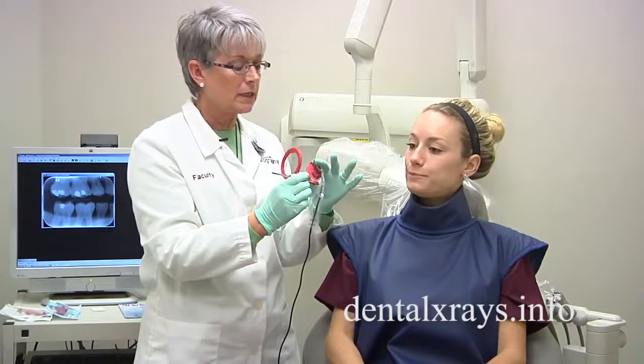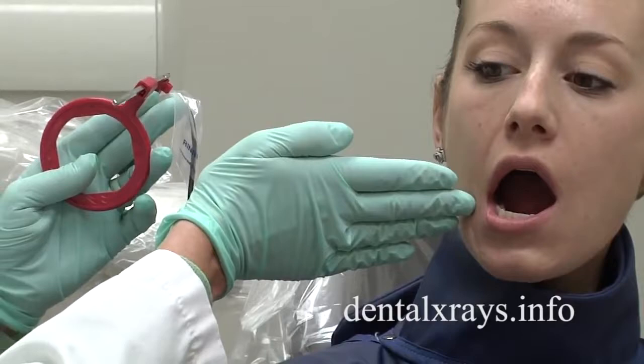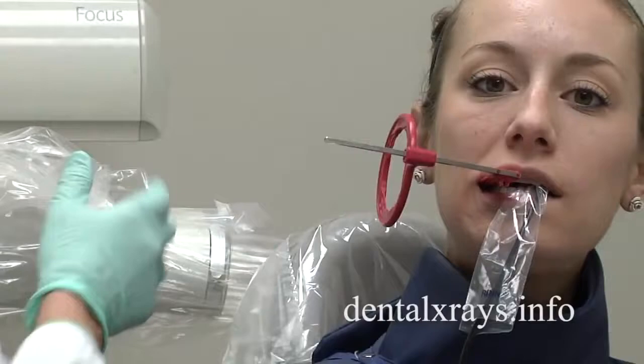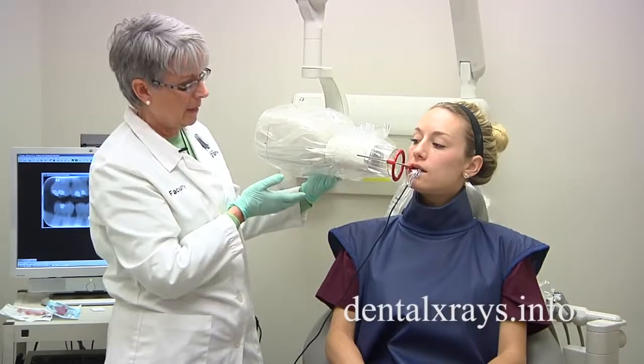So what I like to call is thinking outside the circle. I'm going to see where her contacts are coming in. If I want to have this beam coming in to make the contacts open and it's twisted like this, I'm going to have to think outside the circle and bring my cone coming this way. I'll place it in the patient's mouth, twist it so it's a cross arch, have the patient bite down — and instead of coming straight, I want to come this way, thinking outside the circle and taking the view like this.